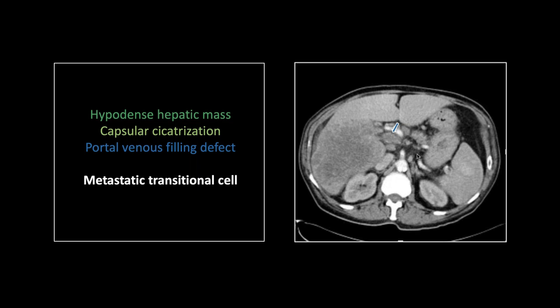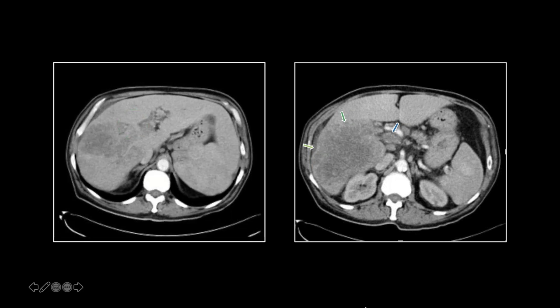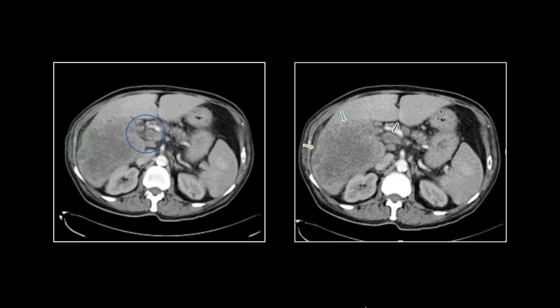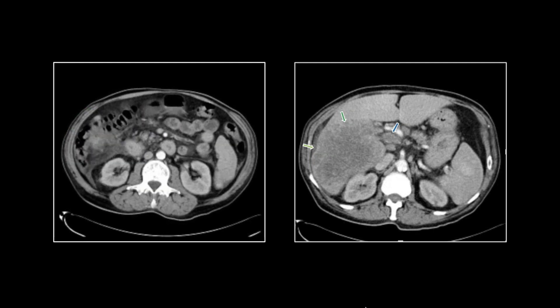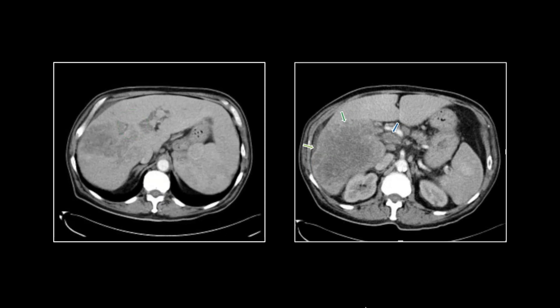Look how smooth that capsule is — this is not a cirrhotic liver. And yet there is portal venous invasion with a filling defect in the portal vein. This is a potential real fooler. It was presented on tumor board as an HCC, and I said this is a met — because metastatic liver lesions will cause focal cicatrization of the capsule, and portal venous invasion is not the exclusive bailiwick of HCC. I've seen breast cancer mets do this; this one was transitional cell carcinoma.